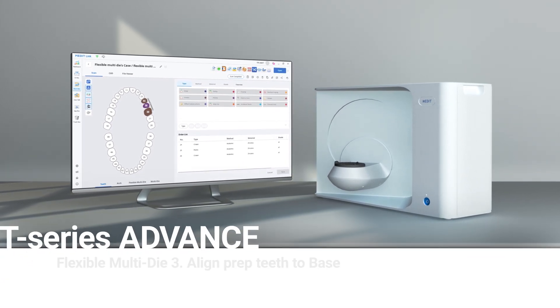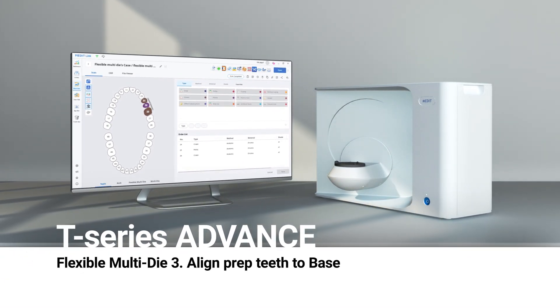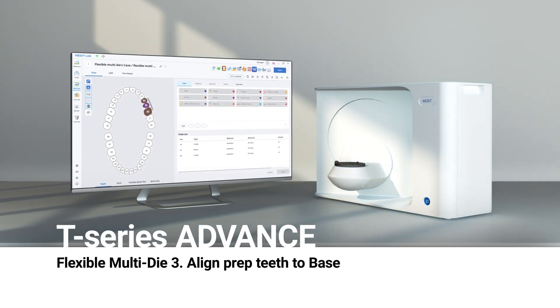This is a quick guide on how to scan with flexible multi-die and align prep teeth to base. This mode is suitable for any size of model to quickly scan and assign data.